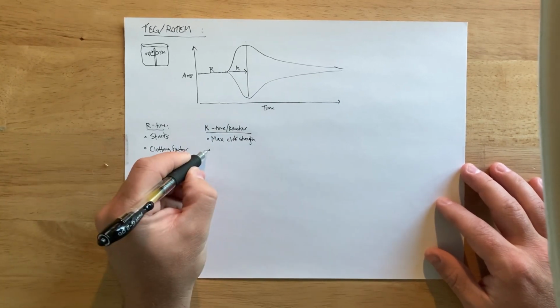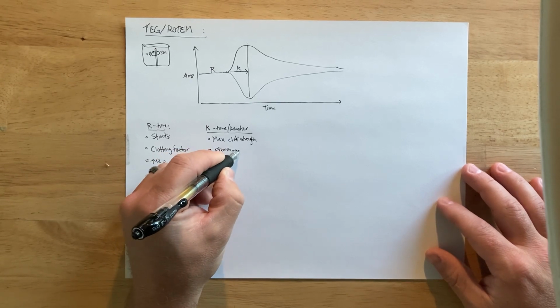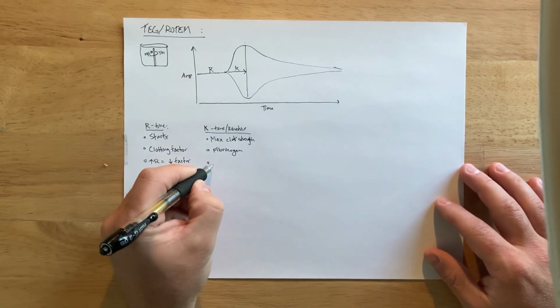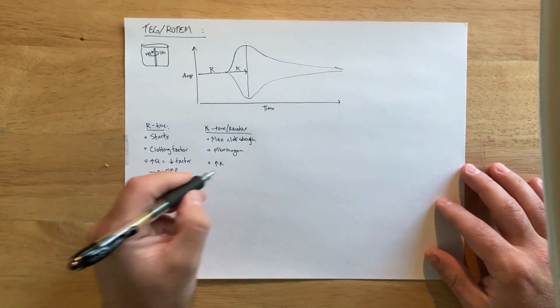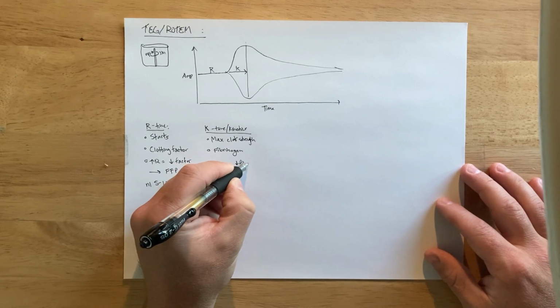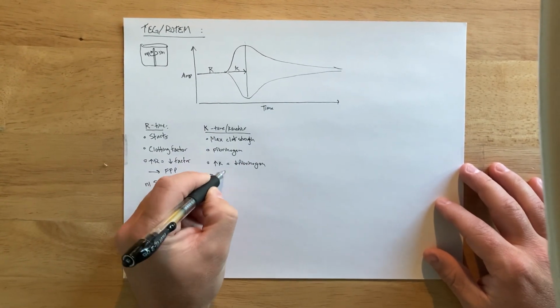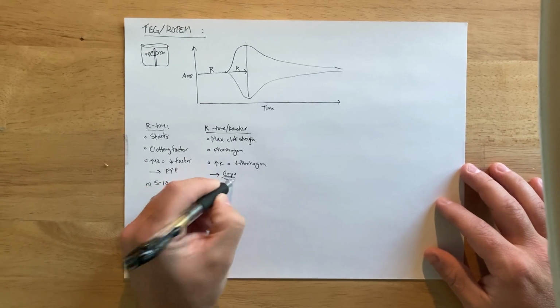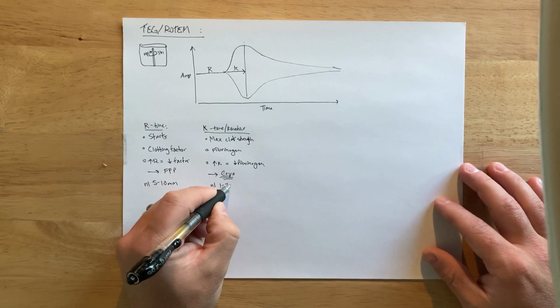The primary factor here is fibrinogen. So if your K is up or prolonged, then that means that you have low fibrinogen, or it's not working. And what you need to give these patients is cryoprecipitate. And normal values for this are anywhere from 1 to 3 minutes.